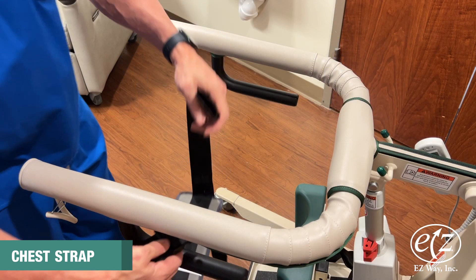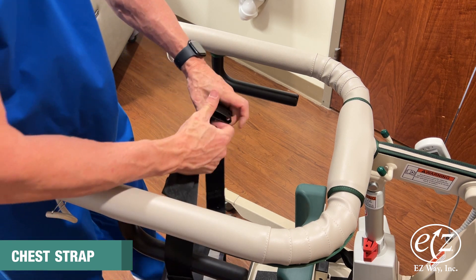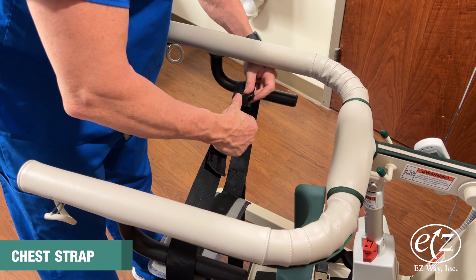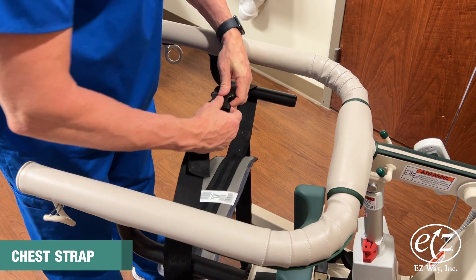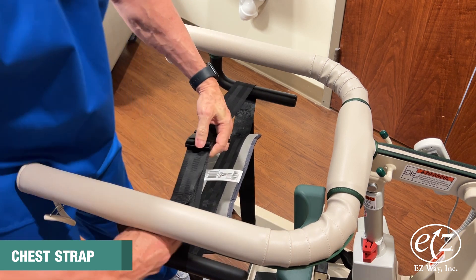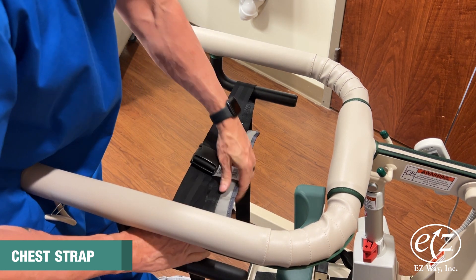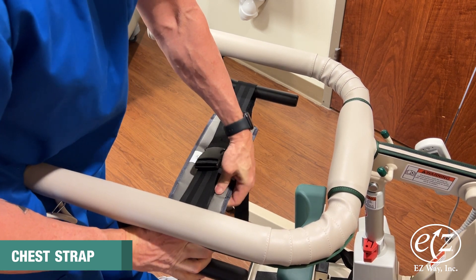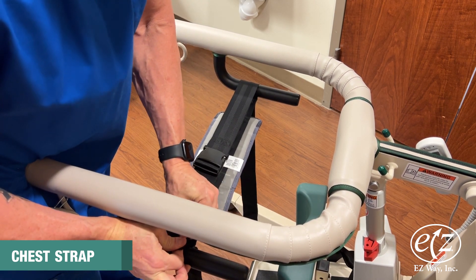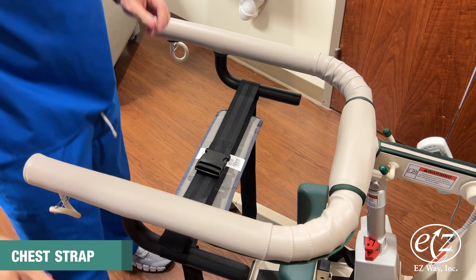Lower the stand arm to its lowest position. With the strap side of the chest strap facing up and the label visible, grasp the shortest strap on either side of the pad. With each buckle or receptacle in hand, reach around the stand arms and buckle the short straps behind the chest strap. Tighten the strap accordingly.